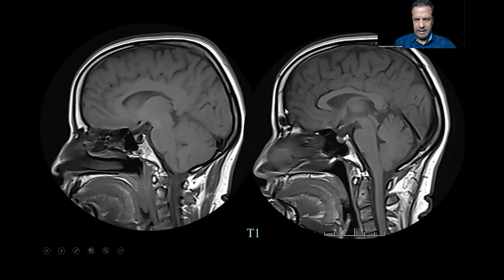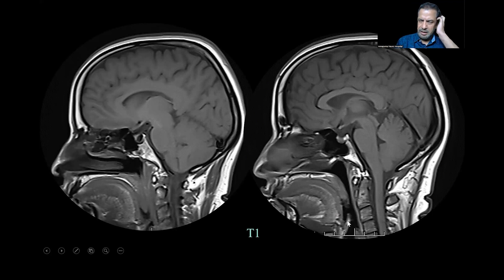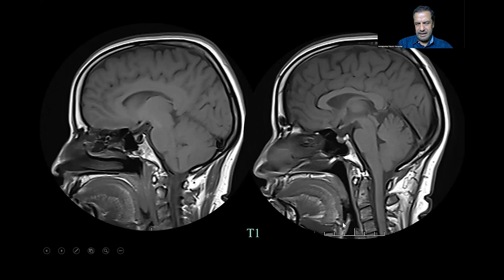This is the cingulate gyrus. Then this is the frontal sinus, nasal septum, nasal bone, tongue, nasopharynx, oropharynx. This is the uvula, and this is the esophagus and trachea, which is just starting there.